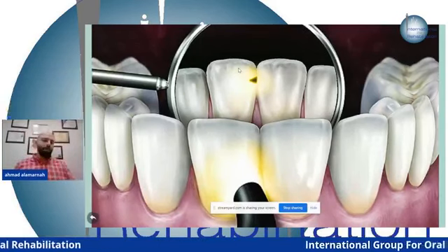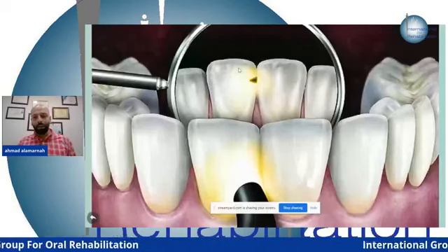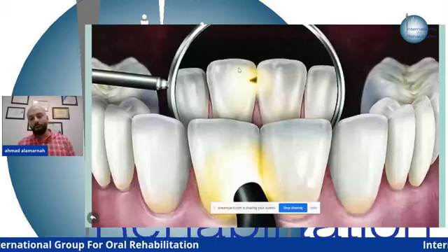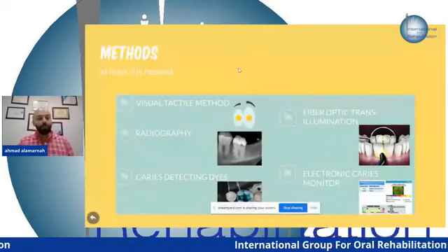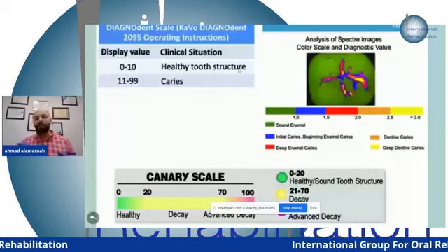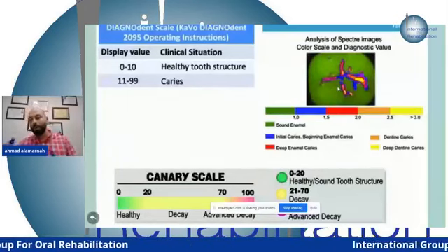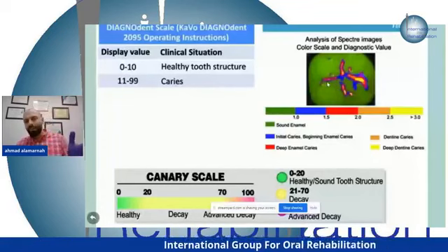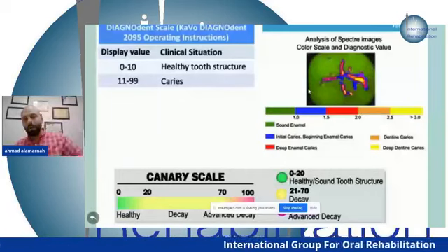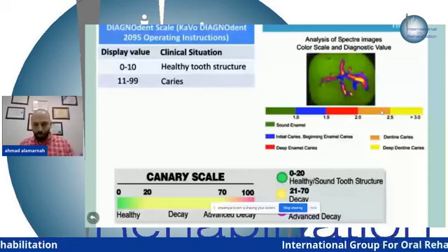Okay. For the visual inspection, you can use a source of light, and you can use the light cure. There is a setting on the light cure to emit light, and you see if there is any hidden cavity, anterior or posterior, anywhere you want. And there is an electronic caries monitor that is like a camera that takes readings within the tooth. Look at the picture here. They have different colors. Each color represents something. Different companies produce different machines like this, and each has its own reading colors. It's very expensive, no need.